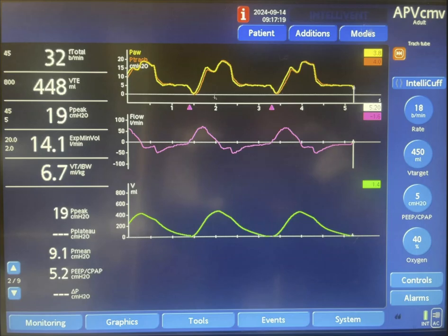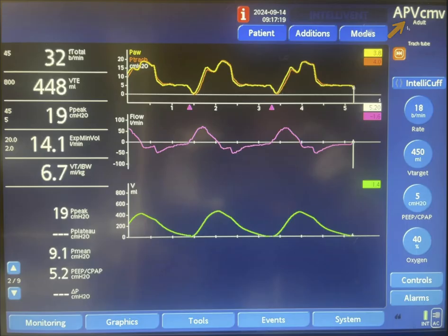Hey guys, I'm going to explain why we have an increase in the inspiratory pressure during inspiration in this patient. This patient is on APV CMV mode, which is similar to pressure regulated volume control mode of ventilation.